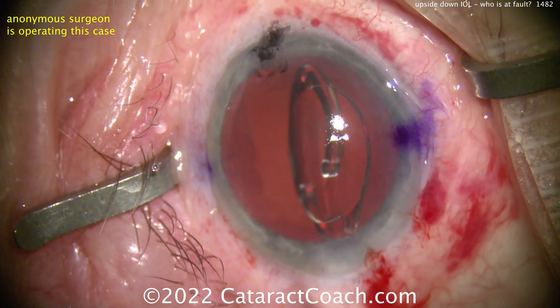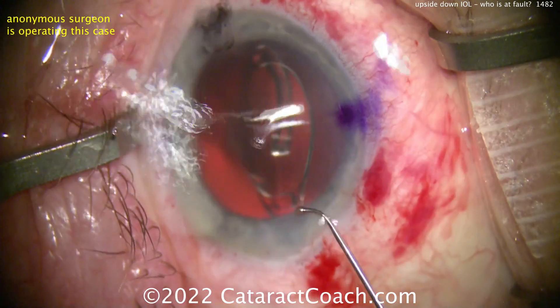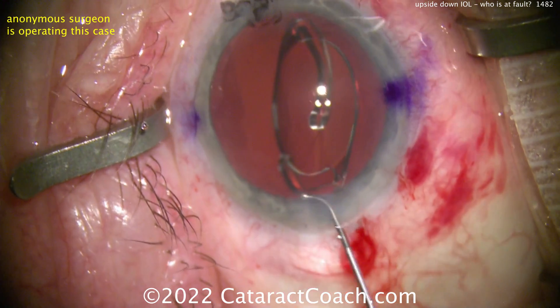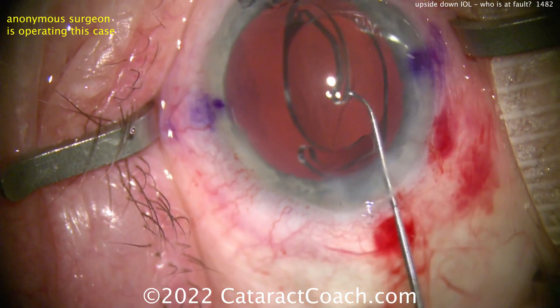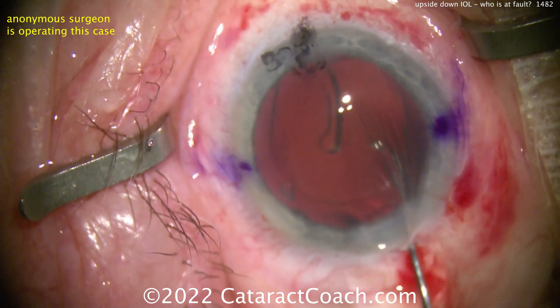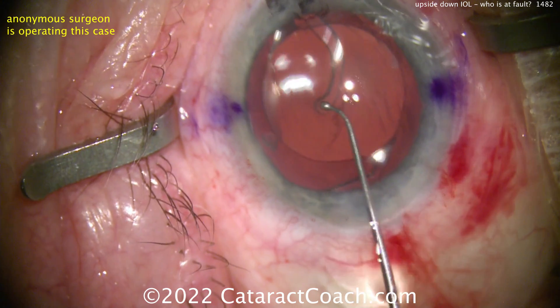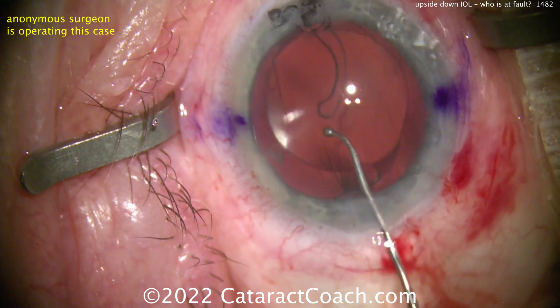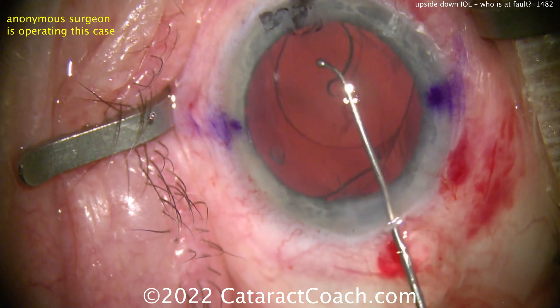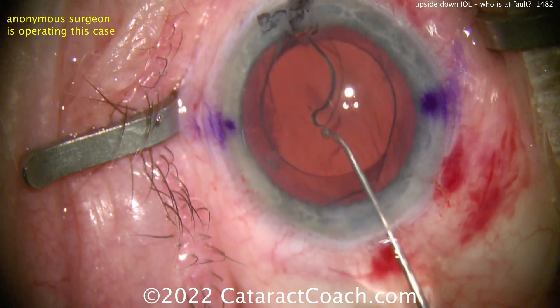With the 7L rule, when the lens is on its side you need to go into the right side of the eye and flip it to the correct orientation. The surgeon goes inside the eye — that's the wrong way — and now there's the dreaded S-sign: the haptics are in the S-sign configuration. The surgeon had an opportunity to flip the lens correctly. I think the lens was loaded correctly into the injector, but it twisted inside and came out on its side.